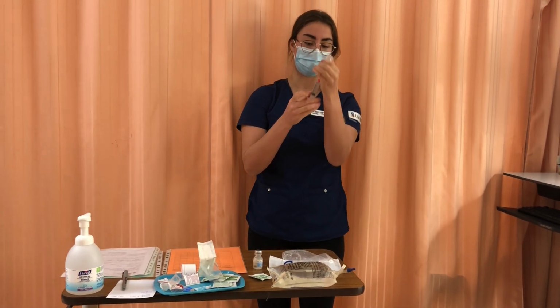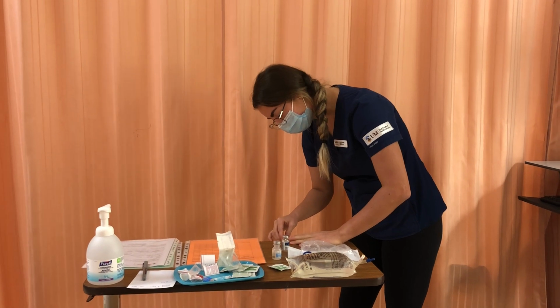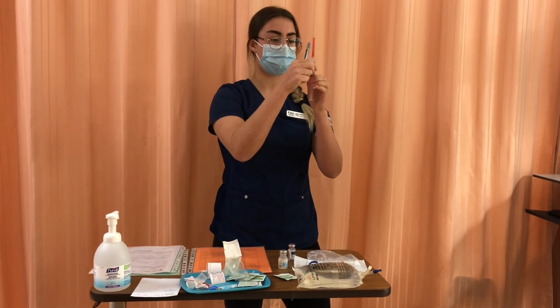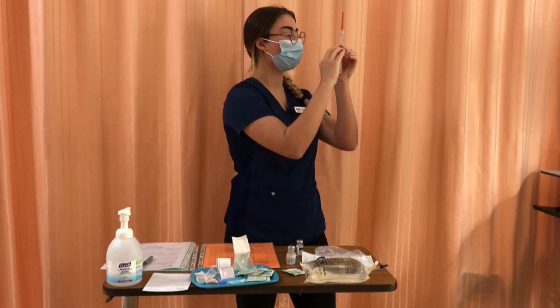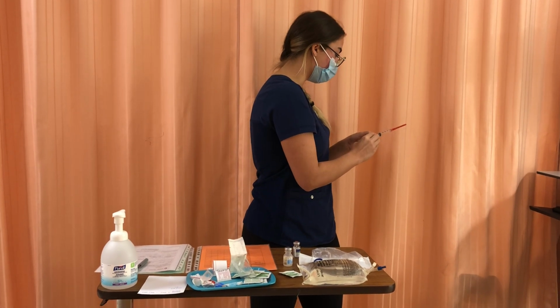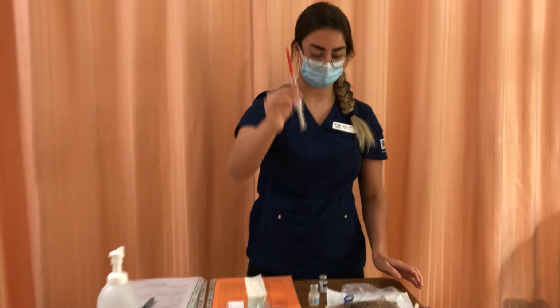So I'll pull a little bit of excess to account for bubbles. I'll recap, pull back and tap out any bubbles that I have. Over the med waste container, I'll make sure that I have my 4 milliliters. I see a blend, so I have it there. Okay, this is a test.